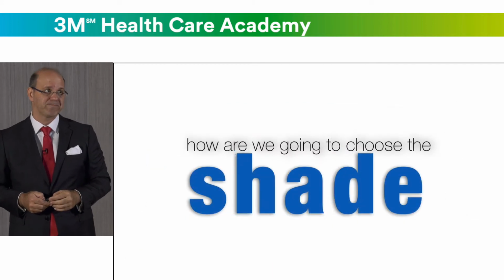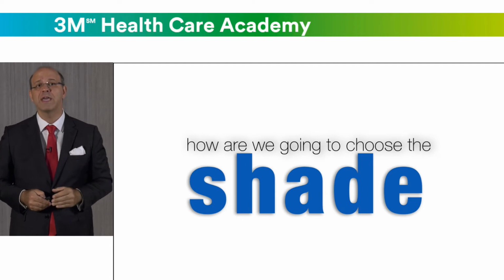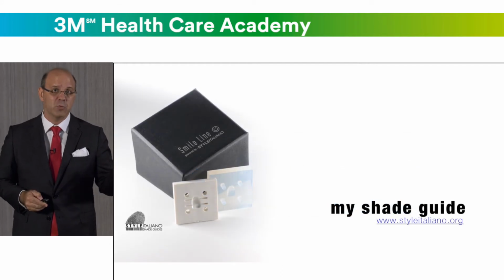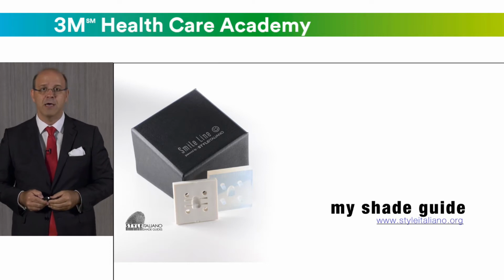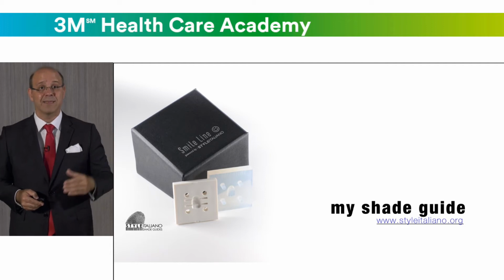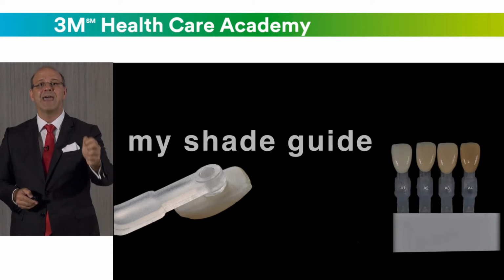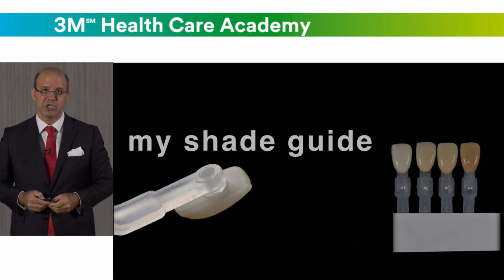Now, how to choose the shade? We have different ways to make the shade selection in our patients. Based on the Vita shade, for example, this is one of the most usual tools that we use nowadays in all dental offices. We can also make a personalized shade guide, like my shade guide. With the same composite we will use on the patients, we can make a shade tab, and maybe it's more predictable in the end to make our shade selection.